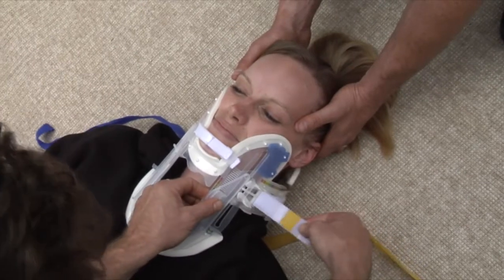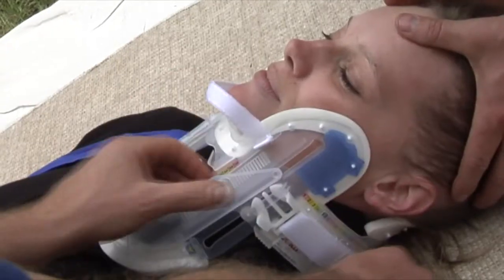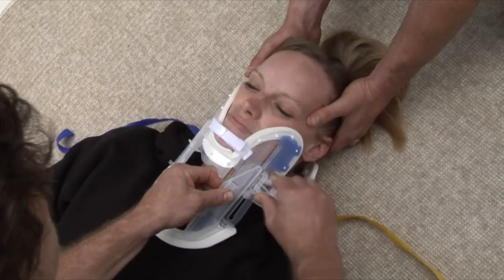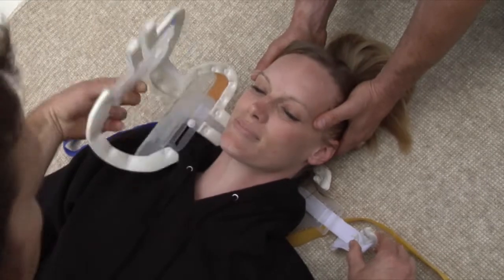Before removing the buckle, slowly release the tension on the X-Collar by detaching the Velcro on the buckle strap. Finally, unlock the buckle and remove the X-Collar from the patient.